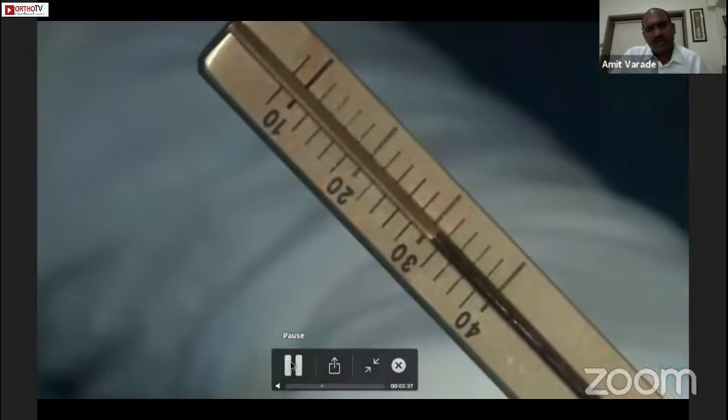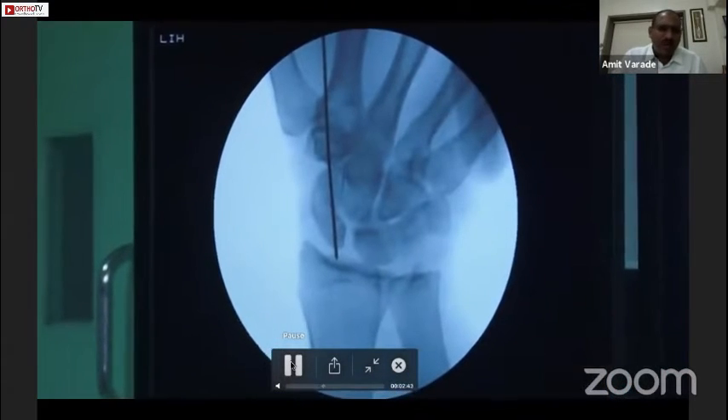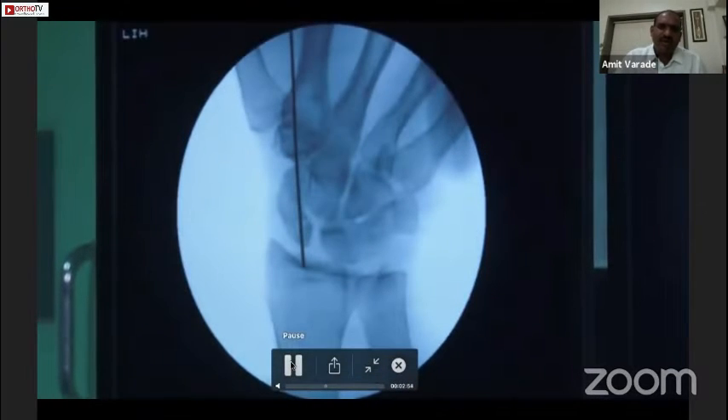The reading here is around 31 mm. One thing we should always remember: we have to subtract 2 mm from the actual length — 1 mm for compression at the fracture site and 1 mm because the screw head can go slightly inside at the head region.